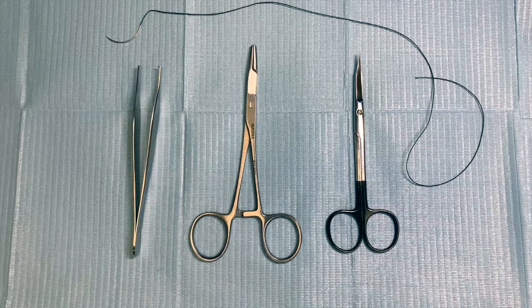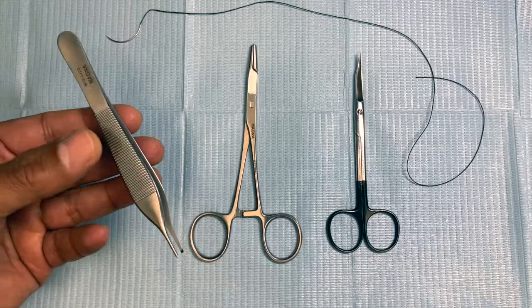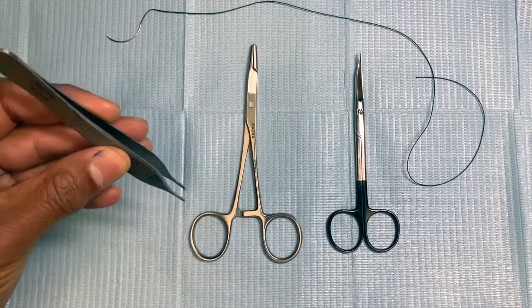As you can see, this is the toothed Adson forceps. This instrument is typically held with three fingers holding one side and the thumb, which gives you the ability to hold and grasp tissues.